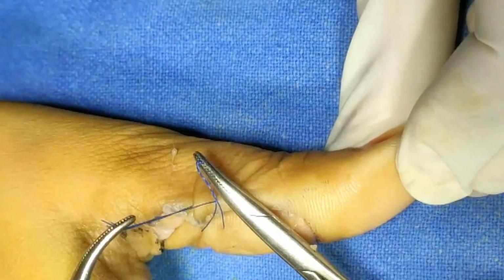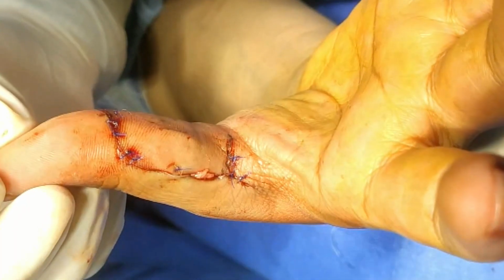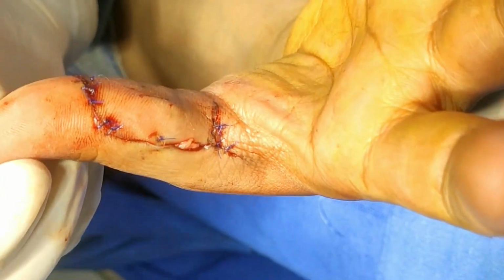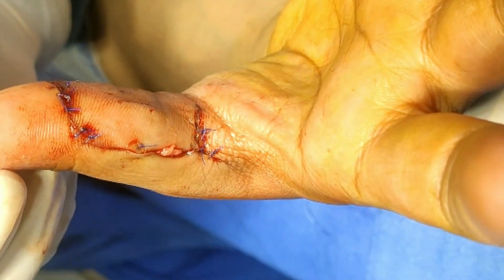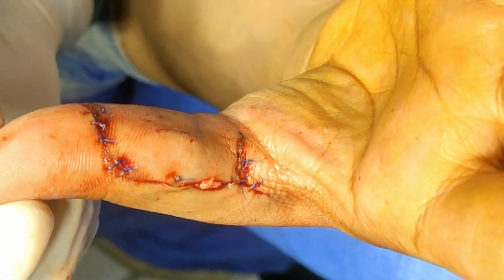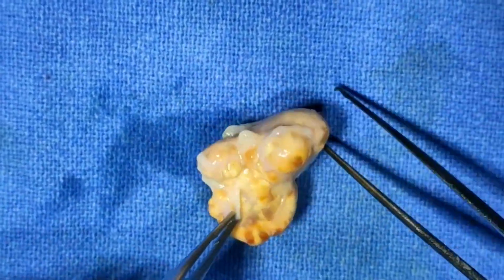Now I will release the tourniquet, and then I will suture it with 5-0 Prolene. After complete excision of the xanthomatous tumor, or giant cell tumor, from the right thumb, I released the tourniquet within 1 hour, and after that I am repairing. I am closing the wound with 5-0 non-absorbable polypropylene, and the tumor was removed in toto.